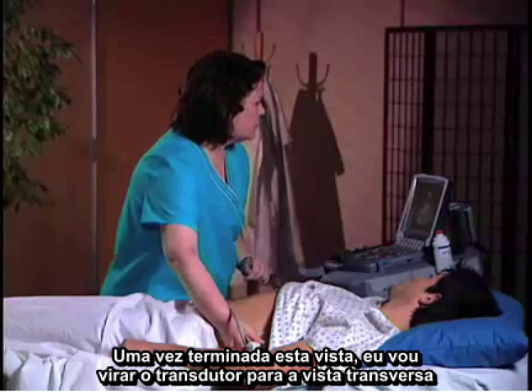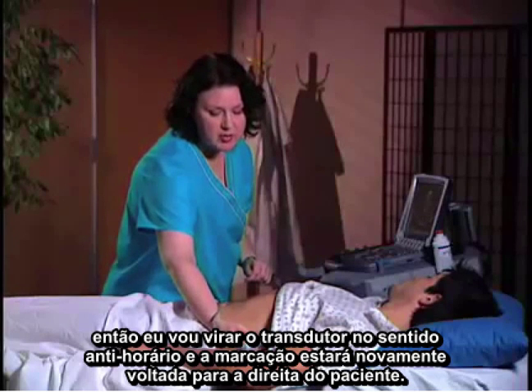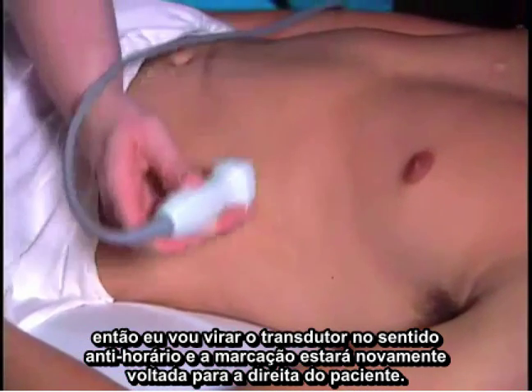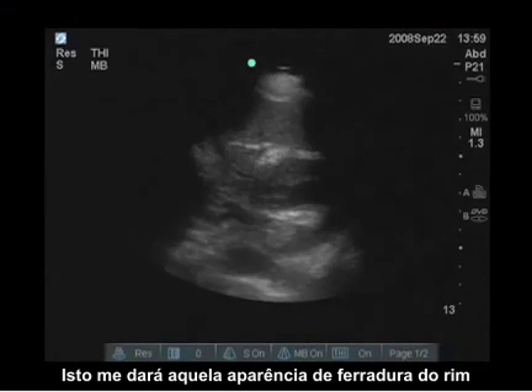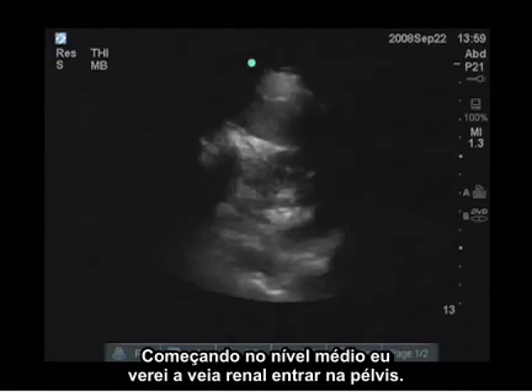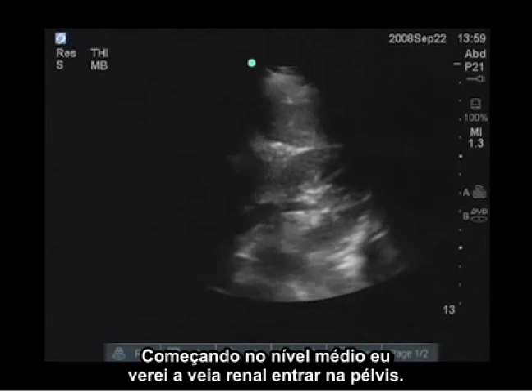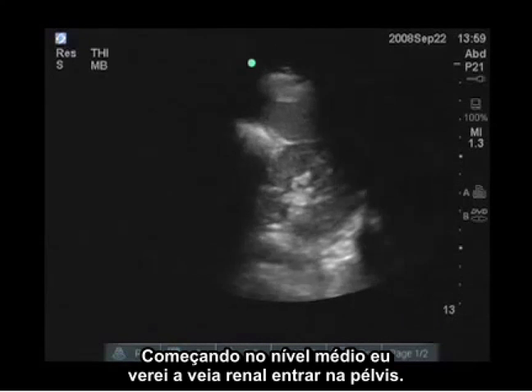Once I've completed this view, I'm going to turn the transducer to a transverse view. I'm going to turn the transducer counterclockwise, and the marker again will face the patient's right. This will give me that horseshoe-shaped appearance of the kidney. If I start at a mid-level, I will see the renal vein entering the pelvis of the kidney.